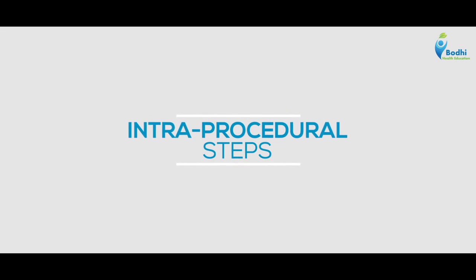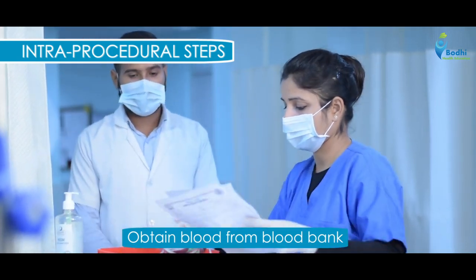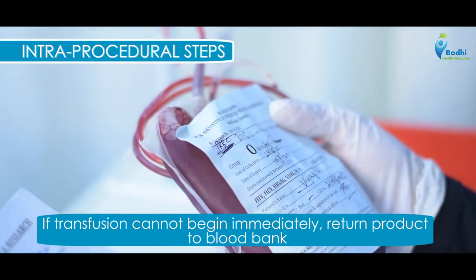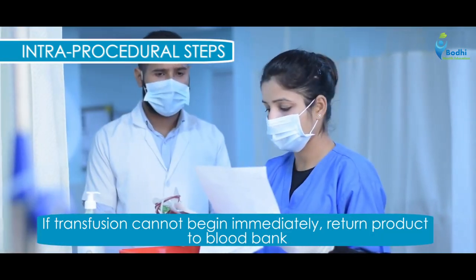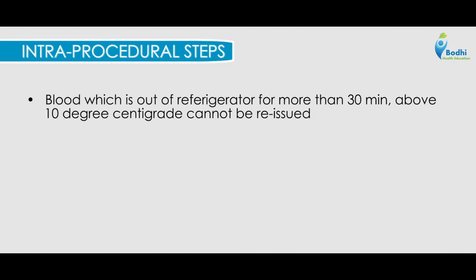Now, moving further with the intra-procedural steps. Obtain blood from blood bank in accordance with agency policy. If transfusion cannot begin immediately, return product to blood bank. Blood which is out of refrigerator for more than 30 minutes above 10 degree centigrade cannot be reissued.